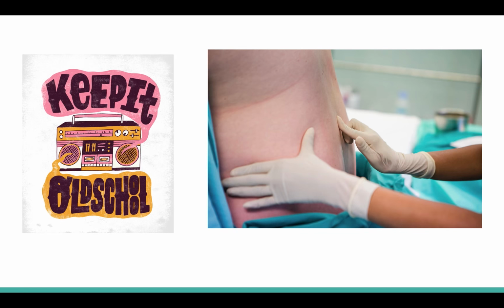One thing I find fascinating about spinal epidural is that there are not a lot of changes in the way we do things. If you talk about airway management, we have video laryngoscope that makes intubation a lot safer. When we talk about peripheral nerve block, we have ultrasound that makes the procedure a lot safer as well. But when it comes to spinal epidural, we're still performing it the same way we've been doing for decades. There's not a lot of changes, but we are pretty good at it.